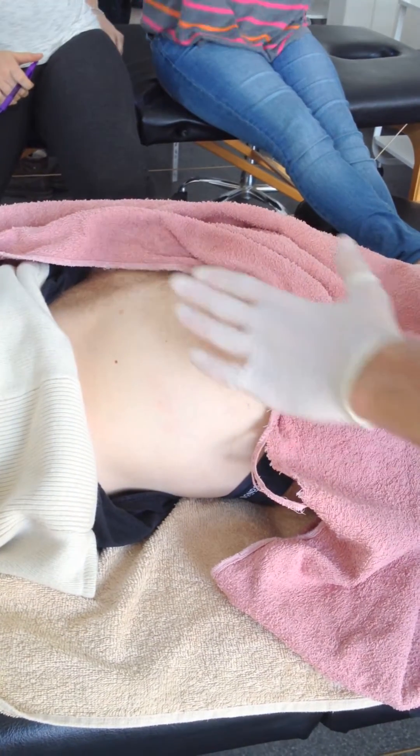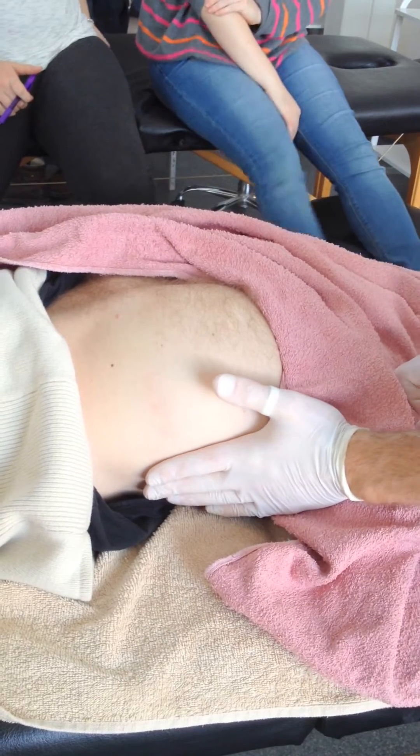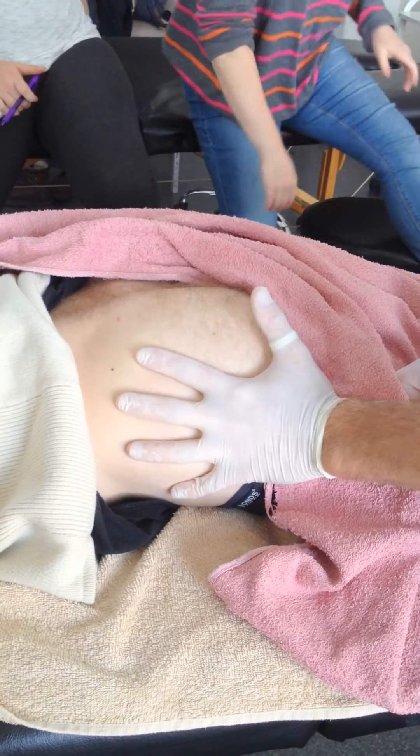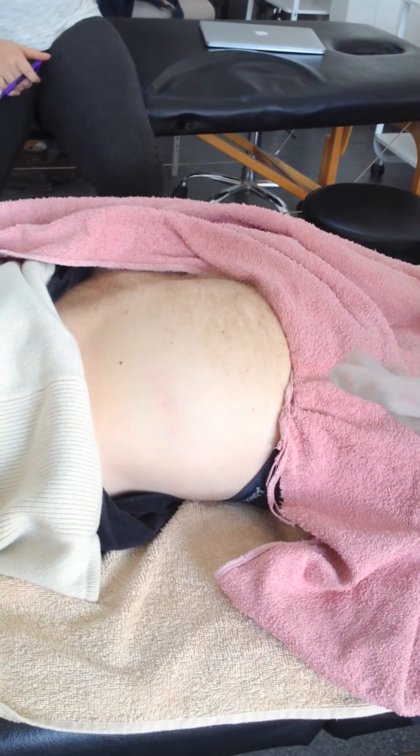We do glute max now. It's the most superficial of all the glutes. Glute min was out through here, which is covered by glute med. And then glute max comes over and covers the posterior portion of glute med.